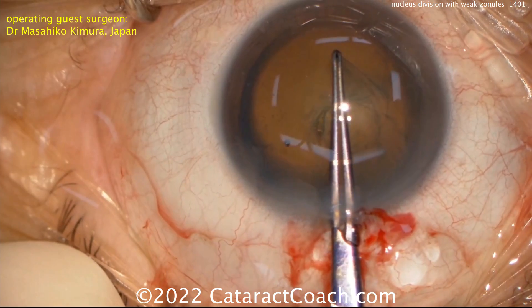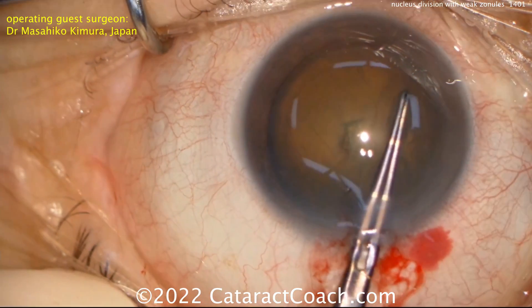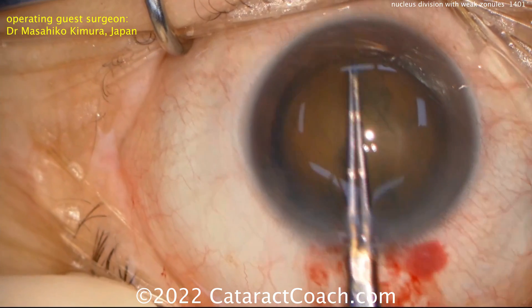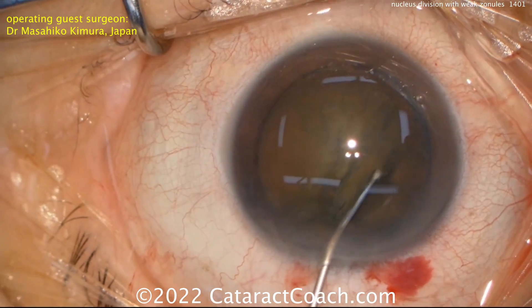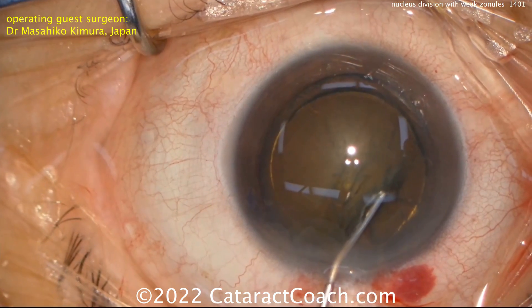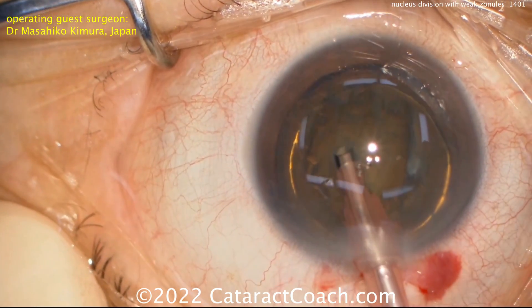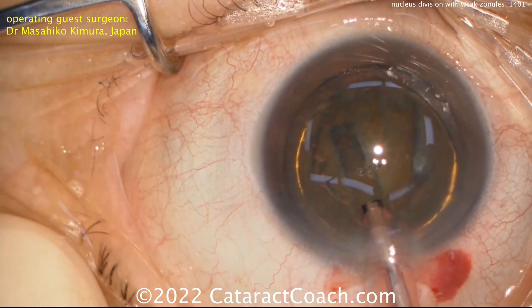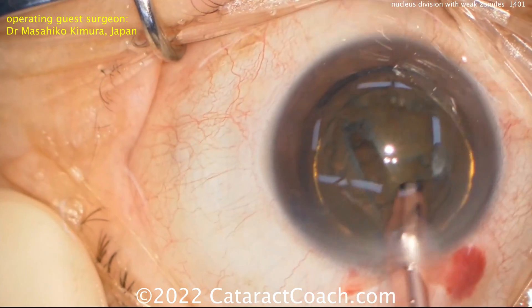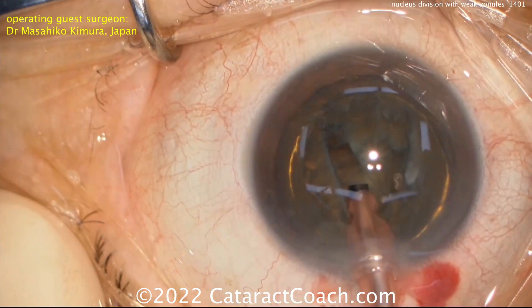I like the idea that we're going to avoid causing more zonular stress here. The rhexis is completed, and you can see those forceps with the marking — so you know it's a 5-millimeter rhexis. You can do a little hydrodissection; there's the golden ring of delineation. And then the V-groove is done in order to split the nucleus into about three pieces. Here's one side of the V, and then you can do the other side as well. This technique has already been featured here on Cataract Coach.